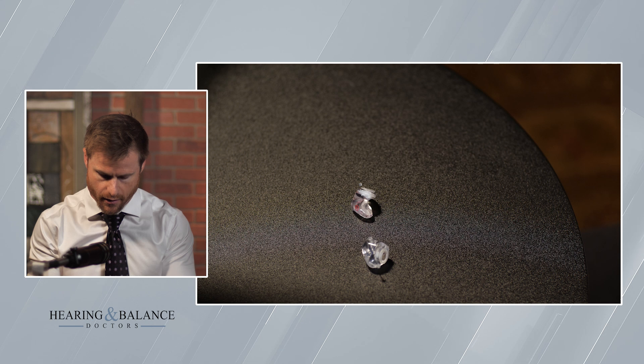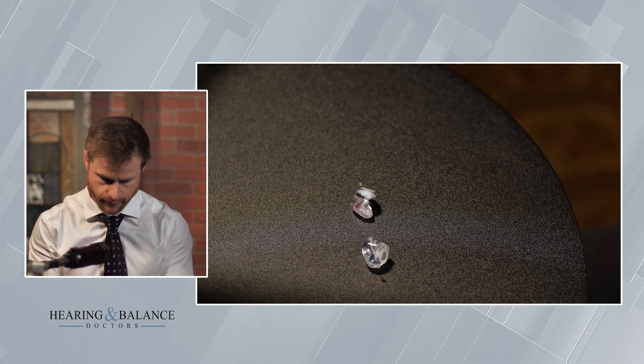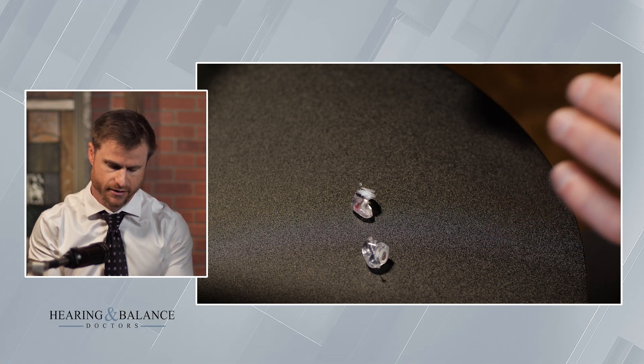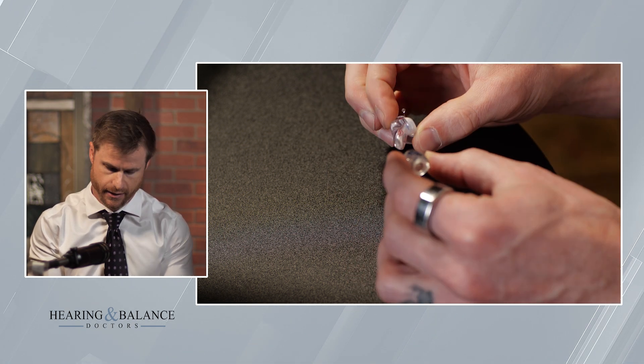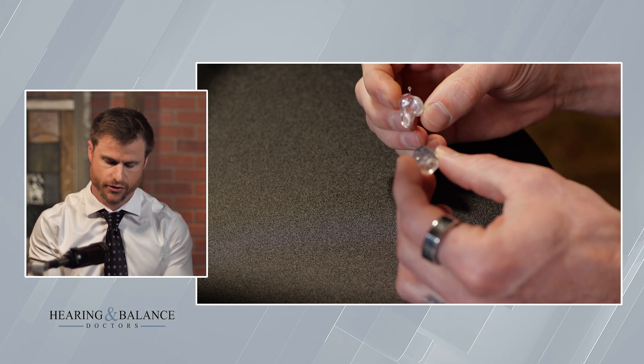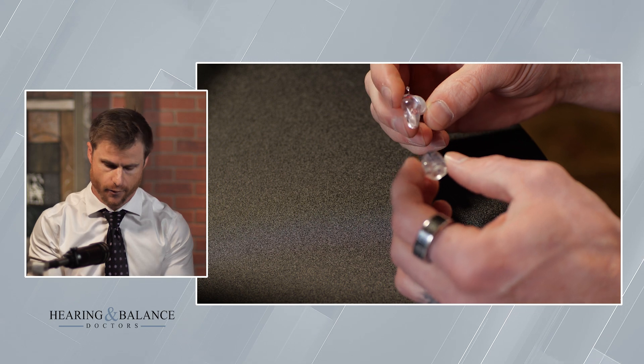There are different types of custom hearing protection. The ones I have in front of me are from a hearing aid manufacturer called Phonak. They just came out with this line of hearing protection. These are called the Serenity Choice Plus earplugs. And these ones that I have right here, they're special for two reasons aside from being custom. One, they are musician's plugs.